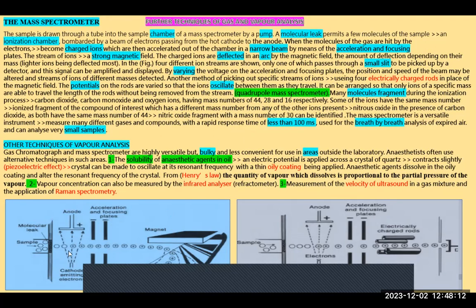But the process of this procedure produces components of each of them. So, for instance, carbon dioxide, whenever it goes through, decomposes into components such as oxygen, carbon monoxide and carbon dioxide. As we know, each of them has a special mass number. On the other hand, nitrous oxide is decomposed to nitric oxide, which has its own mass number. So those degraded components are capable of differentiating between the two main gases, nitrous oxide and carbon dioxide, whenever we have both of them present in the same path. So this is a good thing about it.